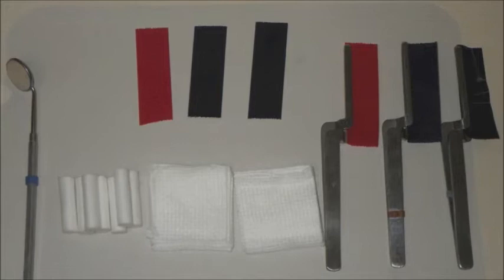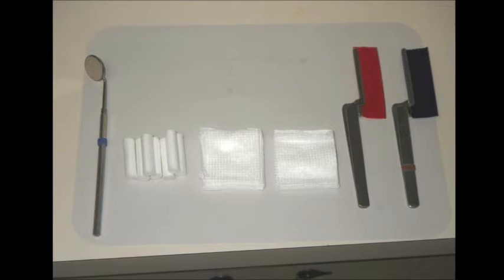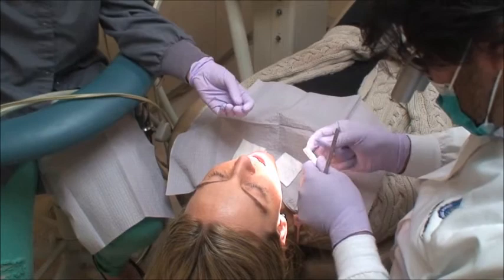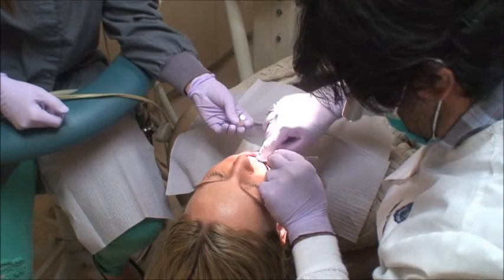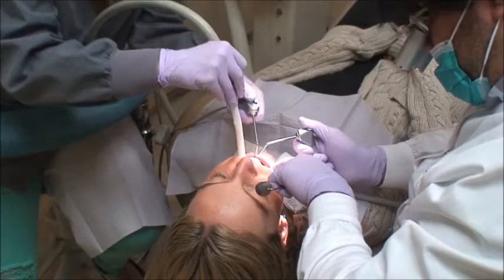I like the articulating paper to be the full length of the plier. This setup is for a simple bite equilibration or bite adjustment — what I'd call an MIP occlusal adjustment or a natural bite occlusal adjustment, which I perform when doing a couple of restorations, fillings, or onlays. As you can see, I'm placing plenty of cotton rolls in the patient's mouth — a couple under the tongue, on the facial and mandible, and on the maxilla. Then my assistant and I dry the teeth using the air syringe.